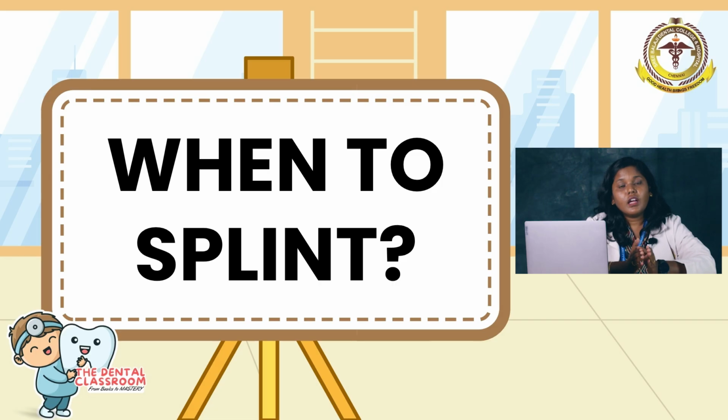So, you have to assess these things radiographically. First, how to assess? We have to check for any widening of the periodontal ligament, and you have to check for the amount of bone loss that has occurred in those regions.